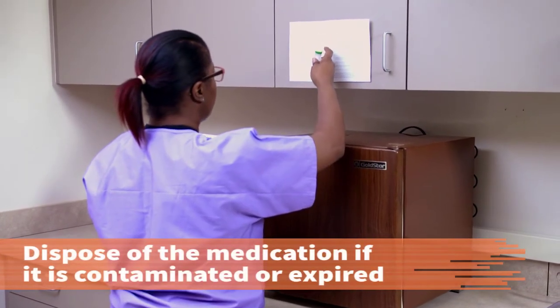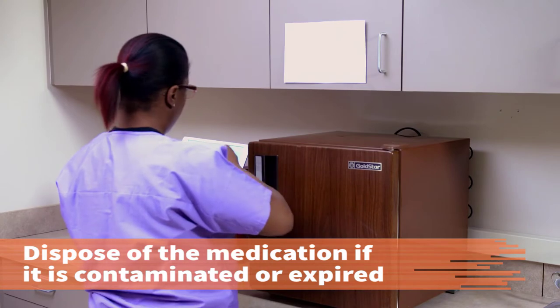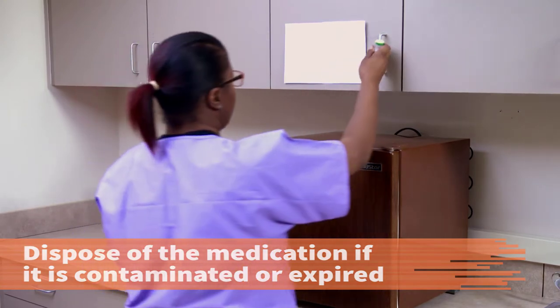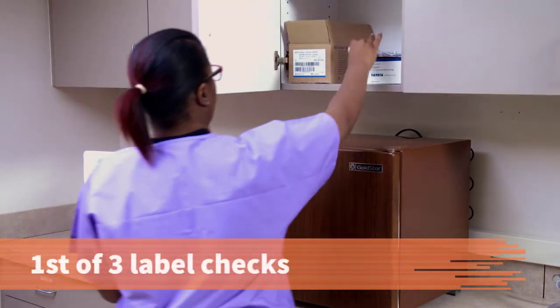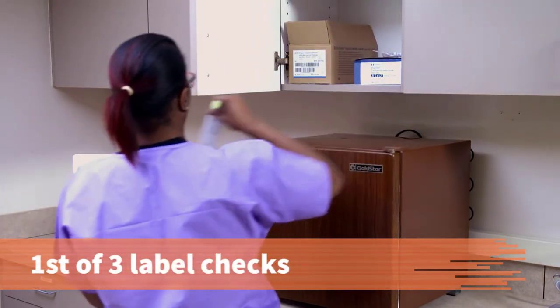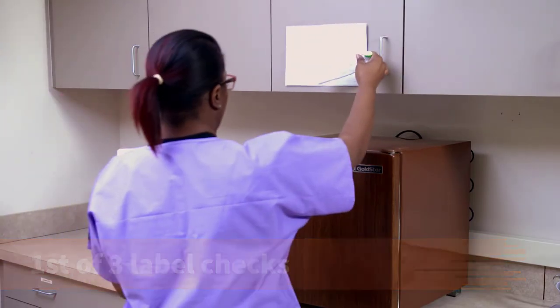Dispose of the medication if it appears contaminated, contains sediment, or has expired. This is the first of three label checks.